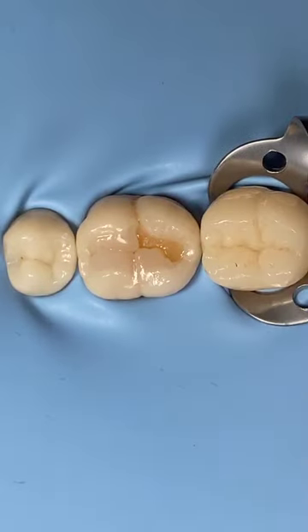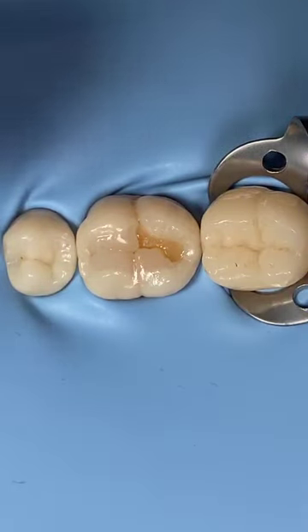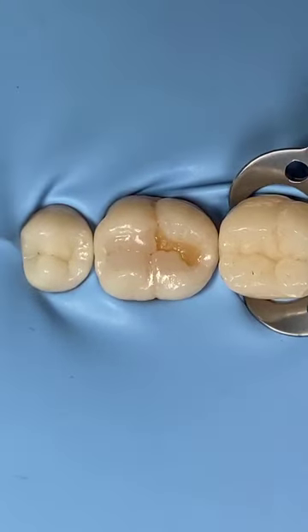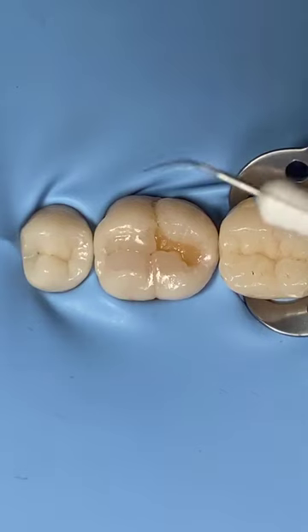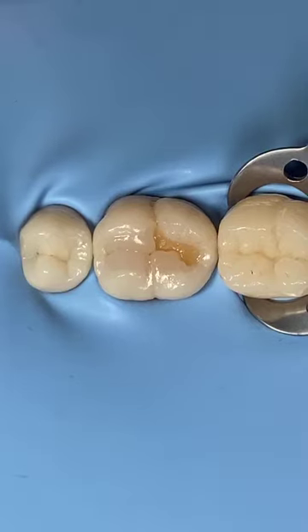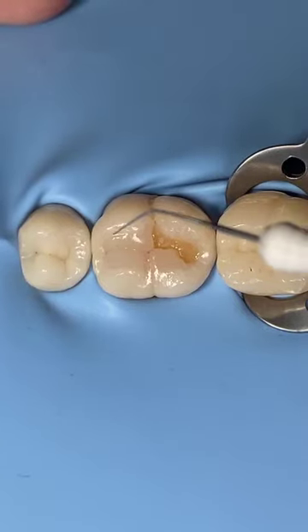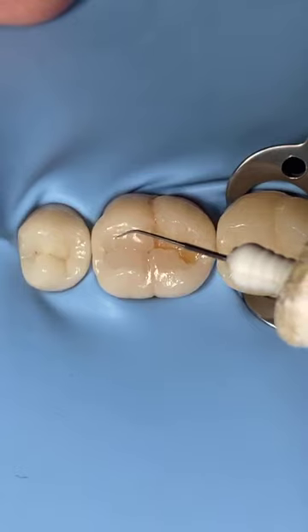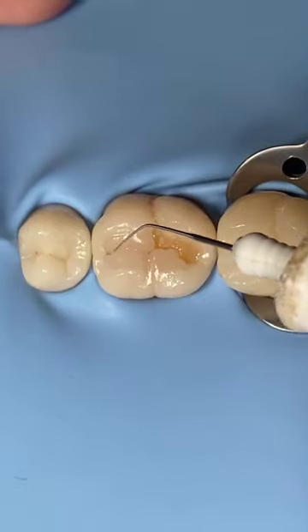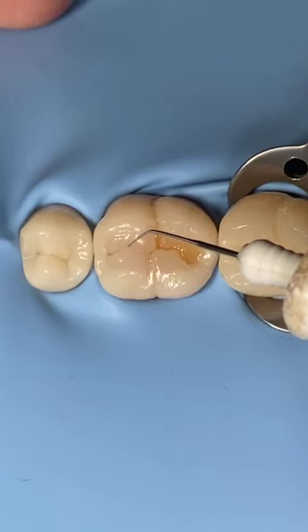So don't worry if it joins, because eventually you will create a gap with your instrument. I will introduce you to a very magic technique. This is called the dot technique. Maybe some of you are a bit confused about how to do carving in this situation. So instead of doing scratching like this, this is the wrong thing.